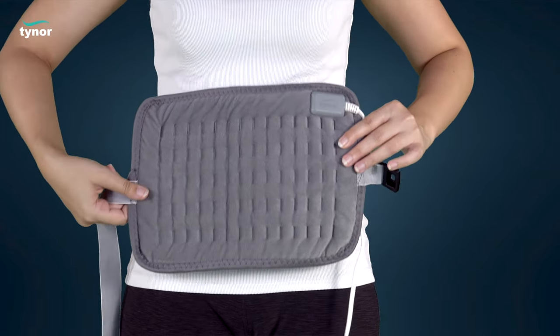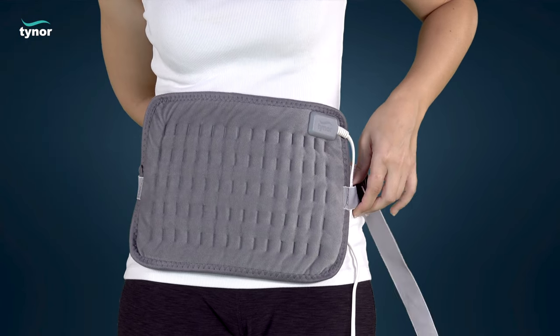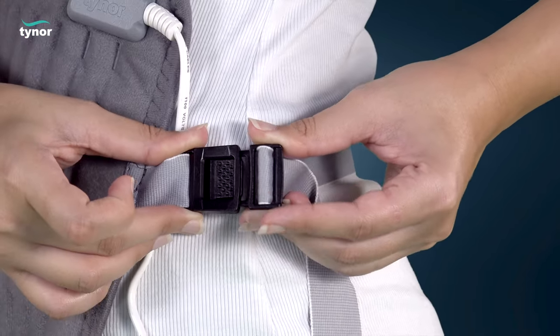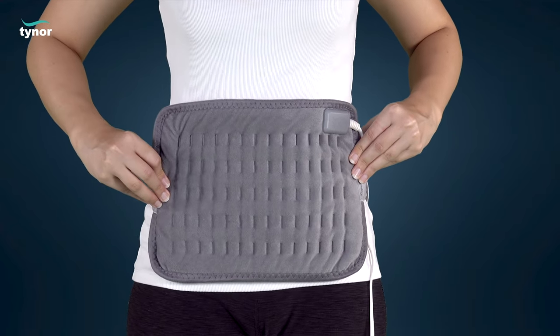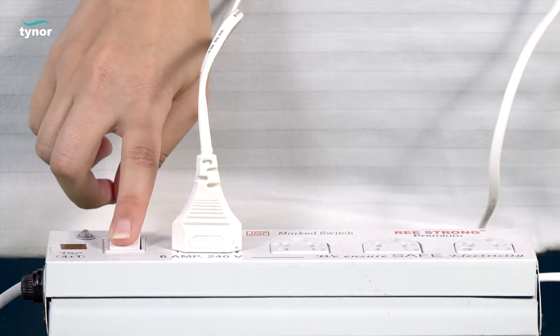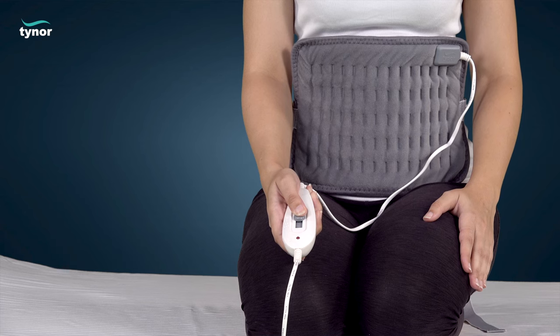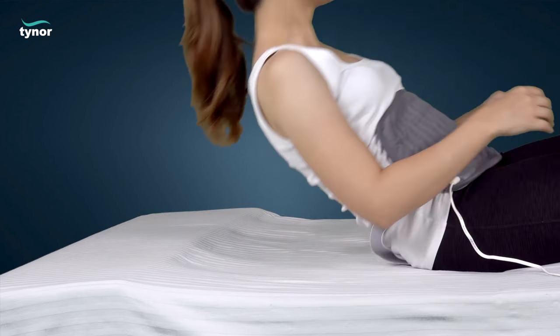Place the Heating Pad Ortho on the affected body part requiring hot fomentation. Plug in the Heating Pad Ortho and switch it on. Switch on the pad from the hand controller, then sit or lie down in a comfortable position.